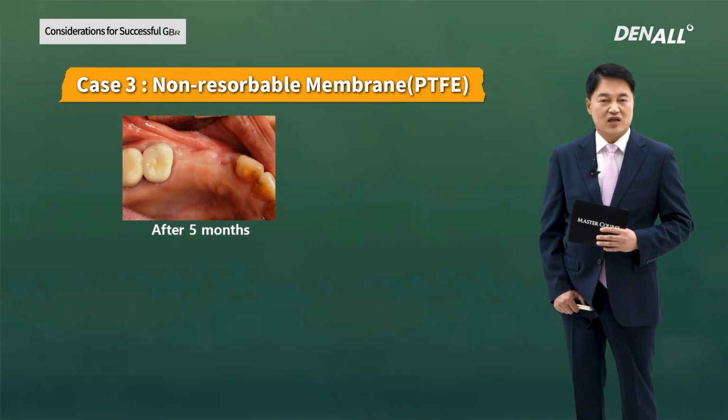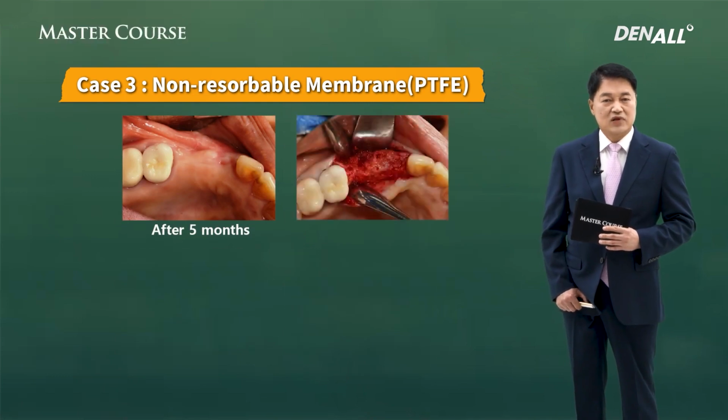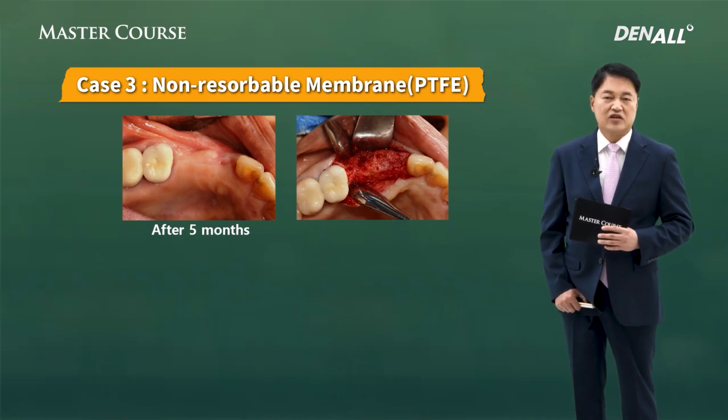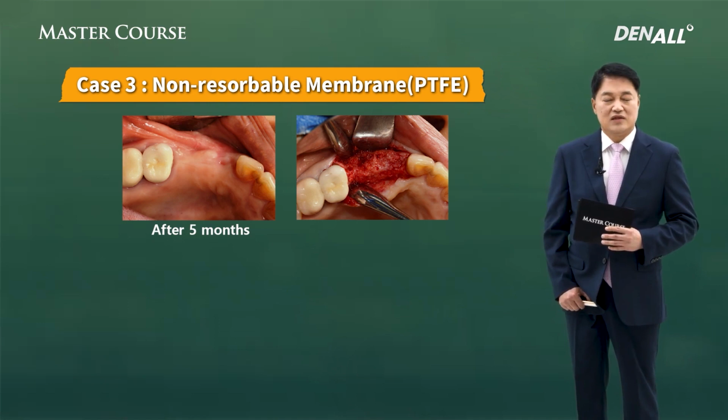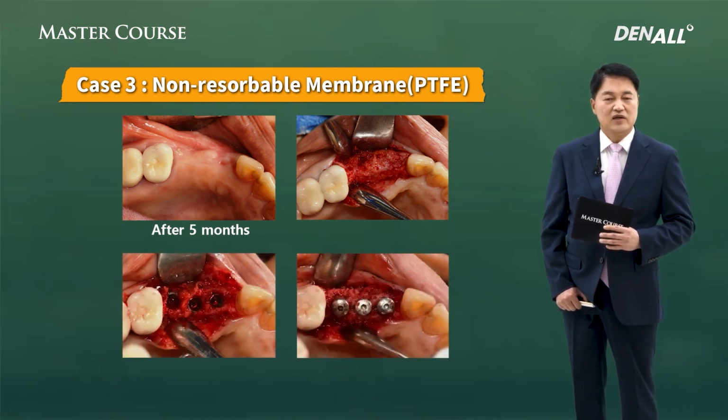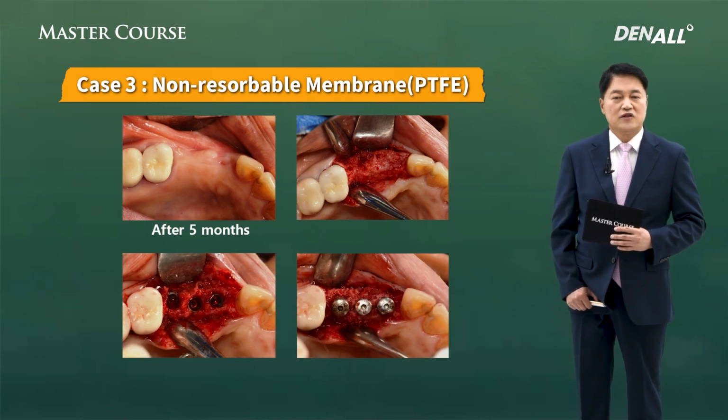Anyway, I removed it, and this is 5 months later. This is when I tried to place the implant. So GBR was rather successful, and I placed the implant. This is after the implant, and additionally bone graft was done. 1-stage surgery was done.